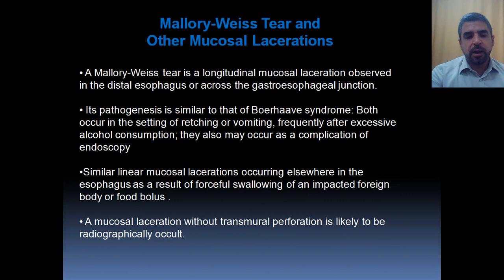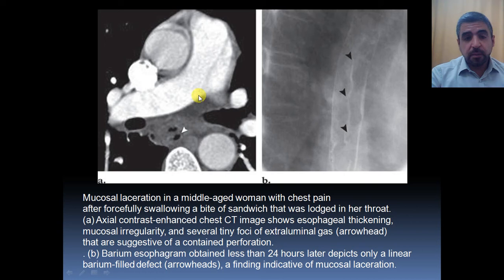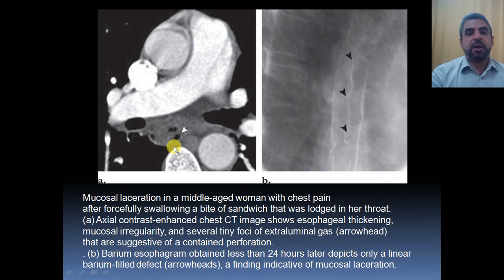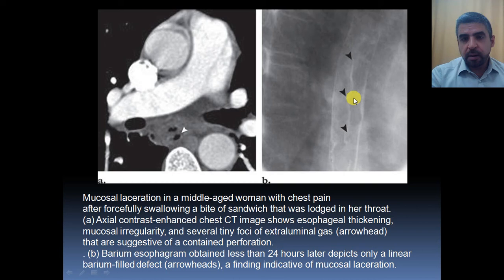For example, in this case — a middle-aged woman with chest pain after forcefully swallowing a bite of sandwich lodged in her throat — on the axial CT you can see air bubbles on both sides. This is an extra-luminal air bubble, and this is the esophagus proper, indicating a contained perforation. There are no other air bubbles surrounding the esophagus and no signs of non-contained perforation. A barium esophagogram performed less than 24 hours later detects only a linear barium filling defect — this is the mucosal line indicating mucosal laceration.